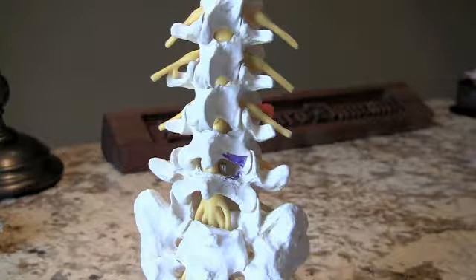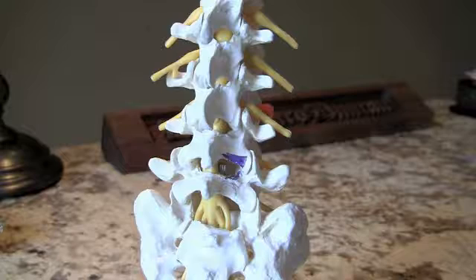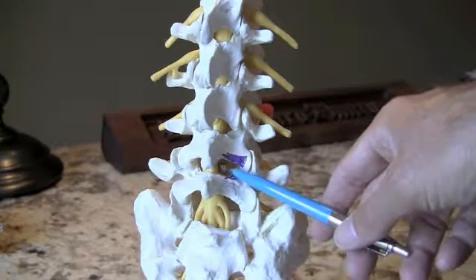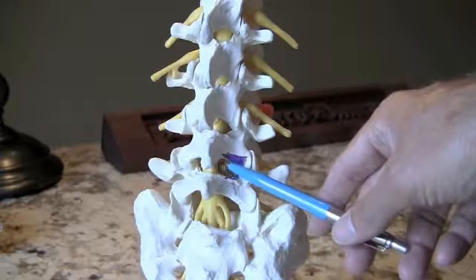This is a model of the spine demonstrating the area of bone that we will take away when performing a microdiscectomy. Most of this area is actually a soft tissue called the ligamentum flavum, so we really don't have to take away but a very, very small amount of bone.